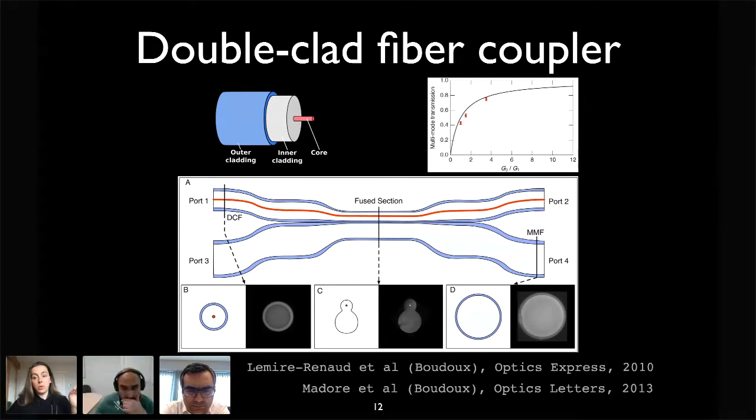Now, if you have some ballistic photons coming back from port 2, those are very precious and you can collect them. They move from port 2 in the core to port 1 losslessly, so you still collect those very high information but low throughput photons.